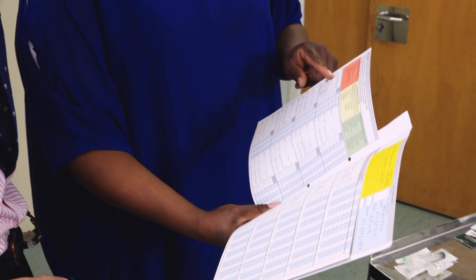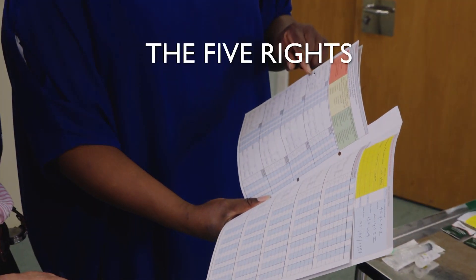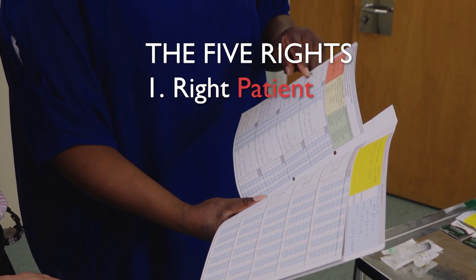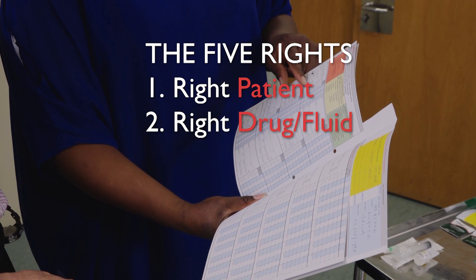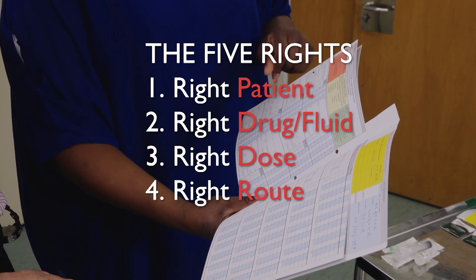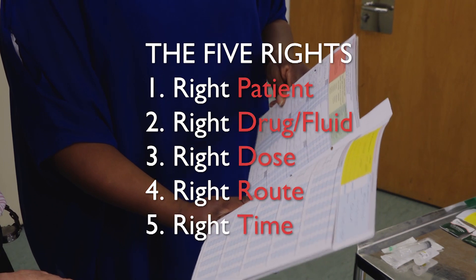Ensure the drug and fluids are prescribed correctly. Use the five rights: the right patient, the right drug or fluid, the right dose, the right route, the right time.